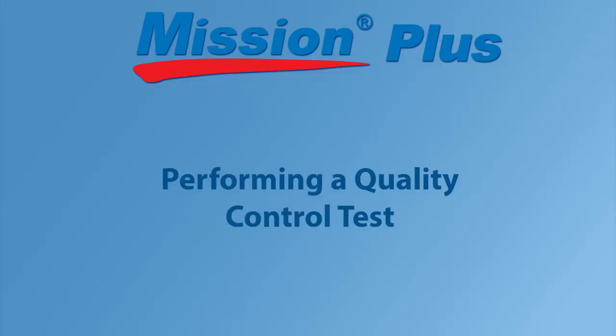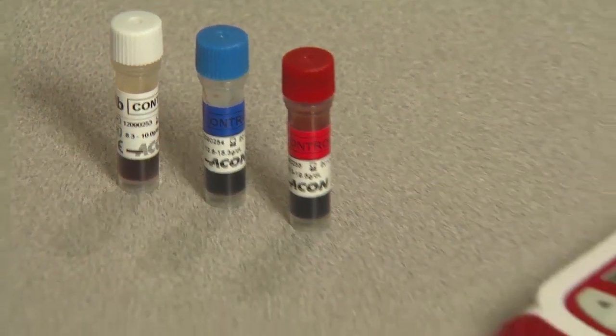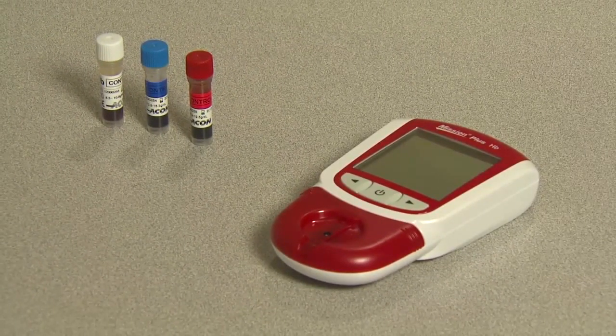Performing a quality control test. A quality control test is performed to ensure that the test device or test strip and the meter are working together properly and that you are performing the test correctly. Mission HB hemoglobin control solution testing is performed in a very similar manner to blood tests using the Mission HB hemoglobin control solutions instead of blood.